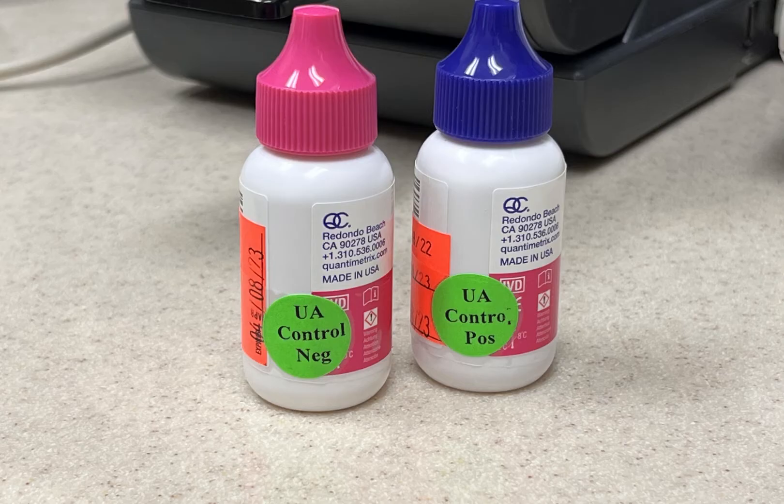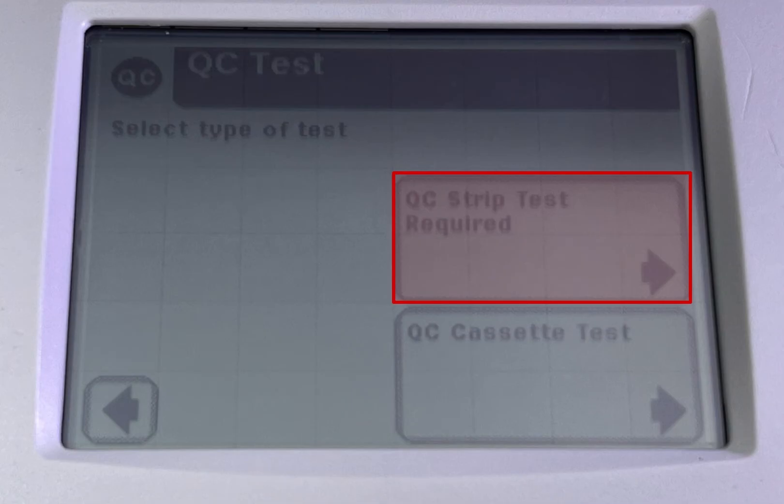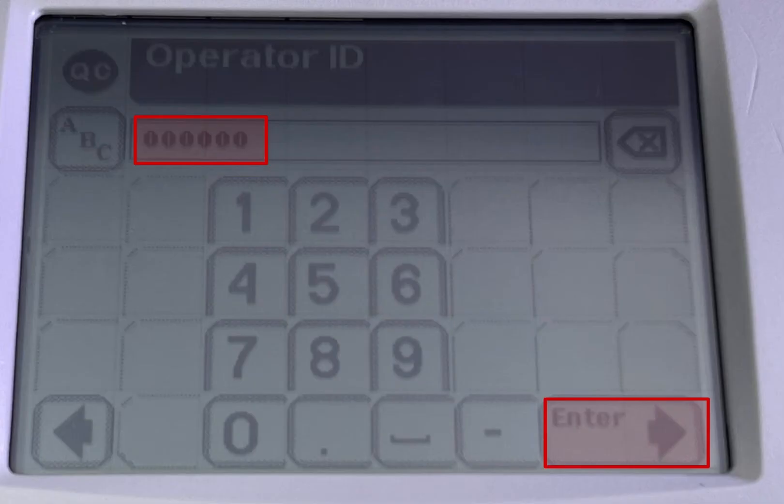The pink control is for negative, and the purple control is for positive. Click on QC test due, then click on QC strip test required. Scan your ID and click enter.